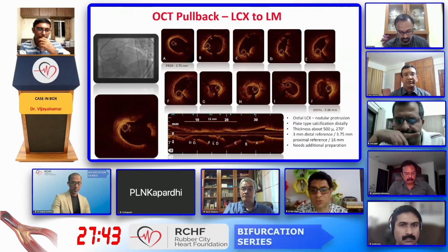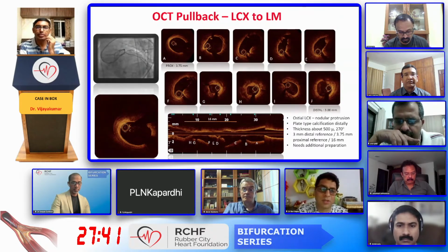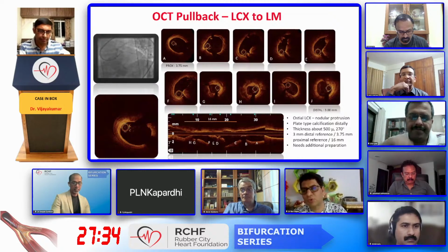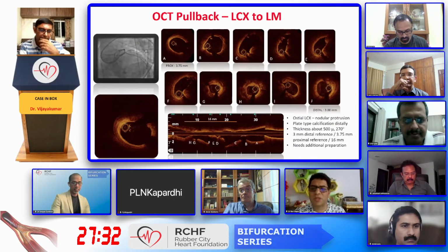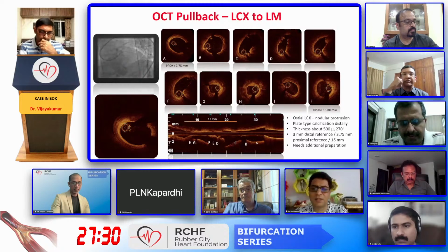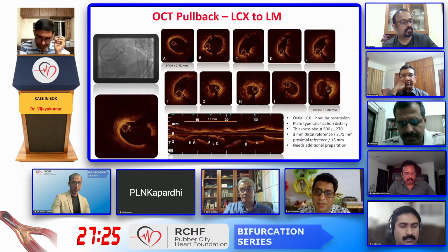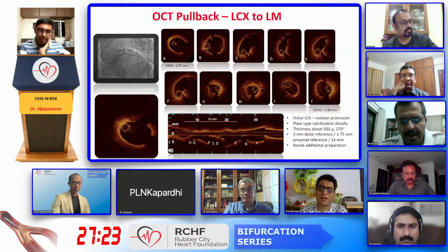Plus minus rota. Maybe you are not able to do the whole job with IVL alone. You may require rota as well, which we call rotatripsy, but probably we should give a try with IVL, and after that we should repeat one OCT. This is my take on this case till now.